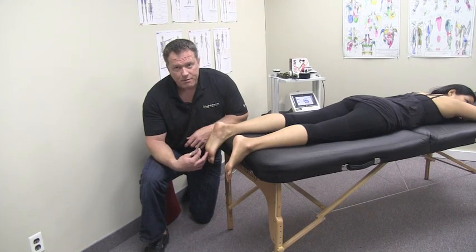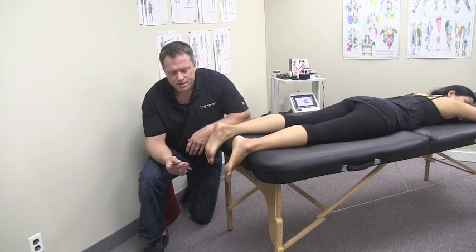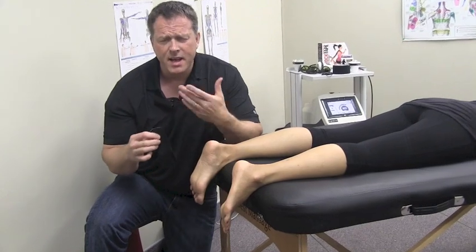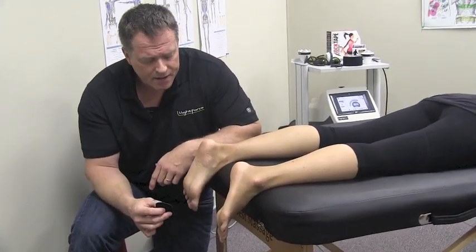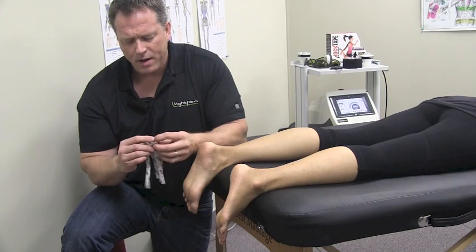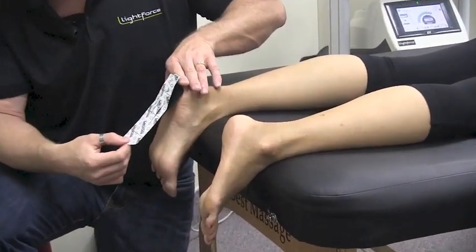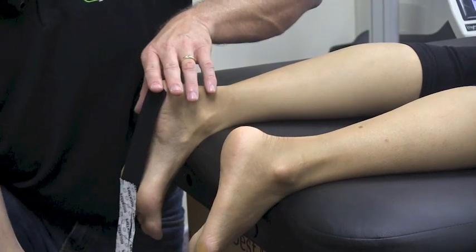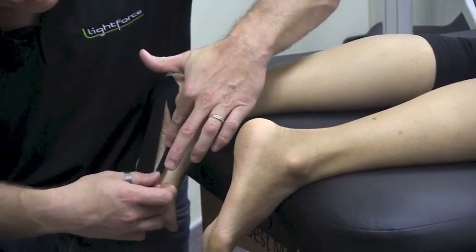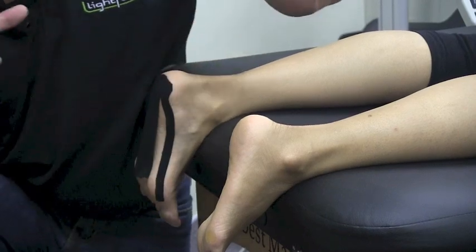I'm going to demonstrate two taping techniques for plantar fasciitis. If it's acute or an acute exacerbation of a chronic injury, you can use the edema tape — a special tape where we cut it into different strips, giving it a different lifting effect on the skin specifically designed to reduce swelling and inflammation. You peel the tape back, set down your anchor point right on the bottom of the heel. Pull all the pieces off and you can see it has a spidering effect — each one goes its own separate way.